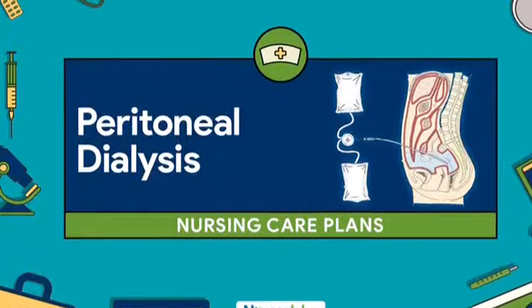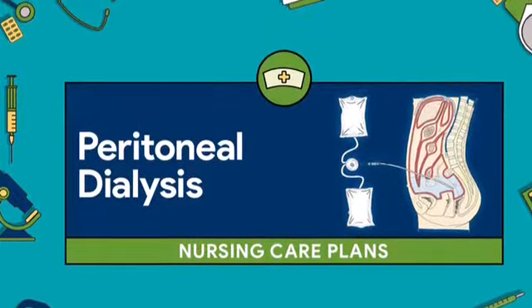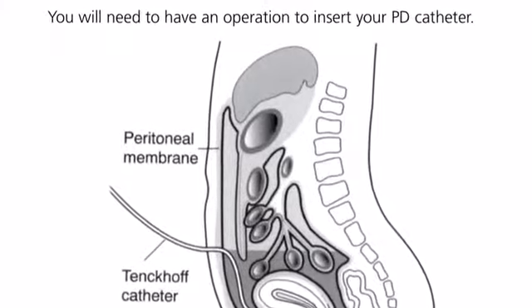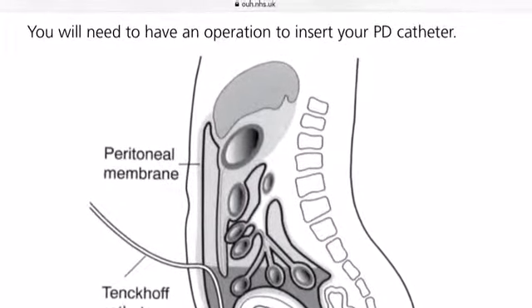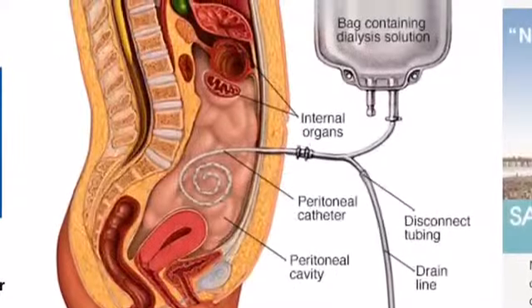Peritoneal dialysis catheter care plan. The role of a nurse in the insertion of peritoneal dialysis is crucial as this is a life-maintaining therapy. The goal of a nurse is to be able to work effectively in handling peritoneal dialysis patients from pre-catheter insertion to post-catheter insertion care. So what is peritoneal dialysis?